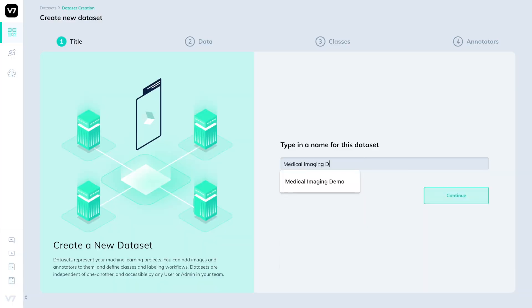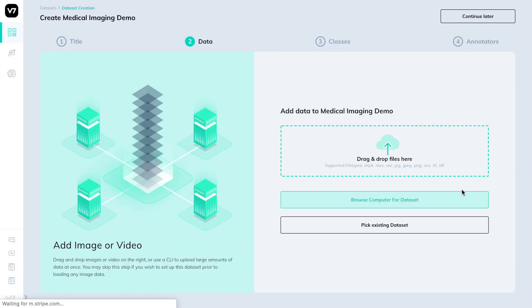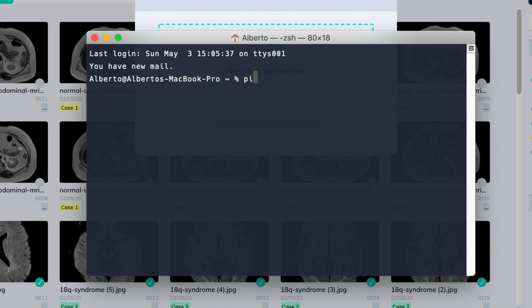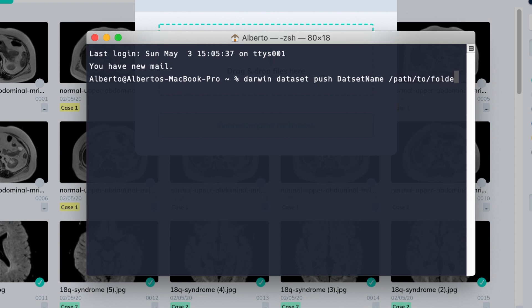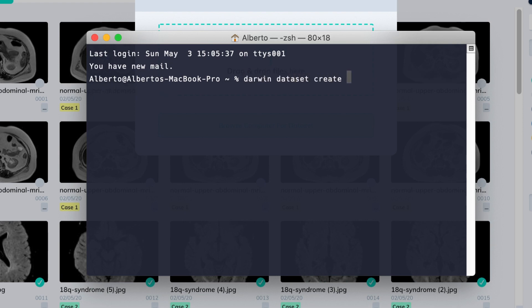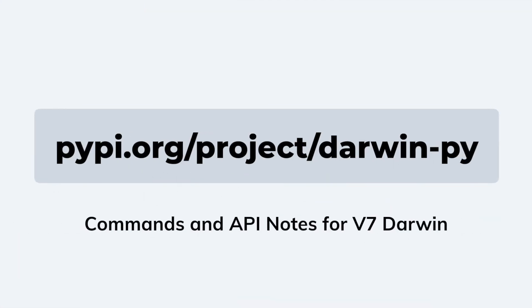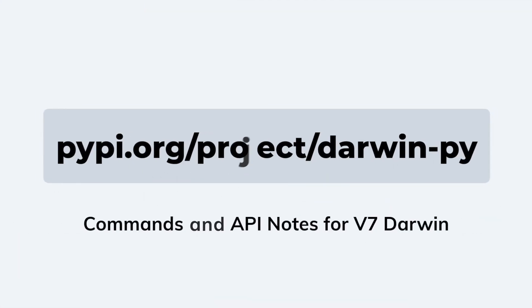Let's start by creating a dataset. We'll give it a name and upload some data. We can do so via the browser or using the CLI by first installing DarwinPy, then DarwinDatasetPush, the name of the dataset we created, and the path of the files we want to upload. You can also create the dataset with DarwinPy — find all these commands and shortcuts on pypi.org/project/darwin-py.